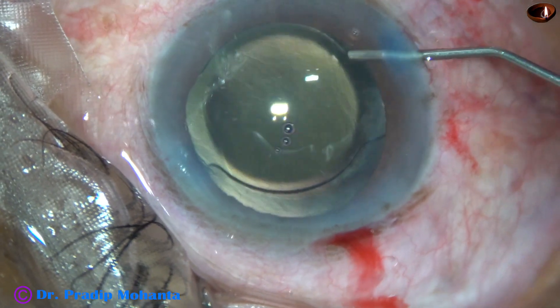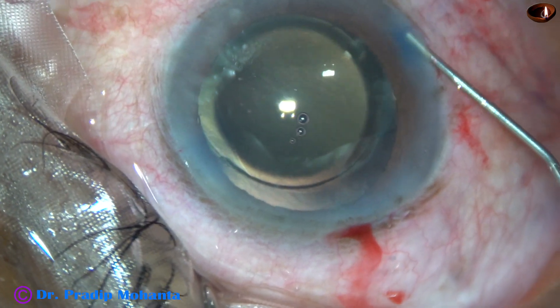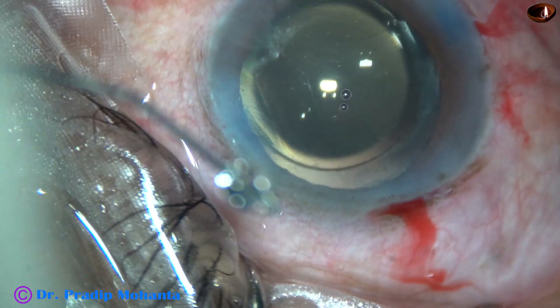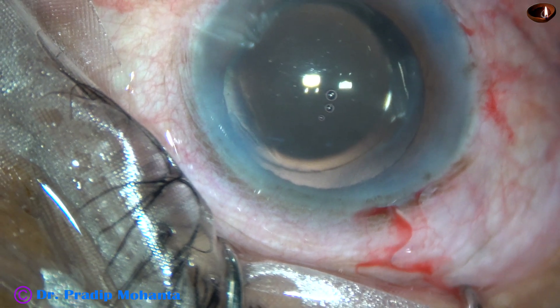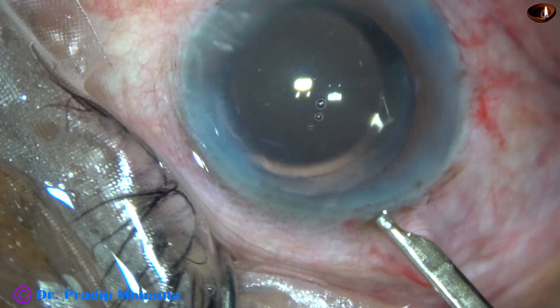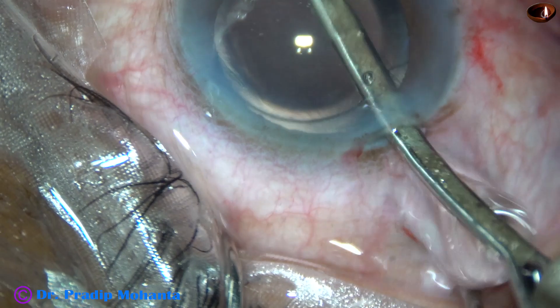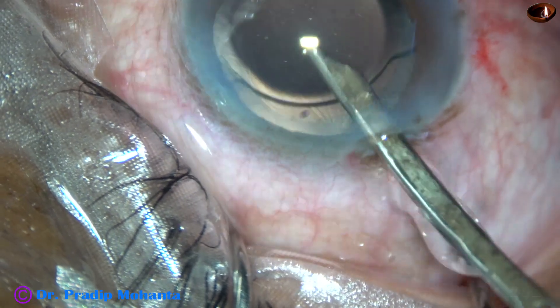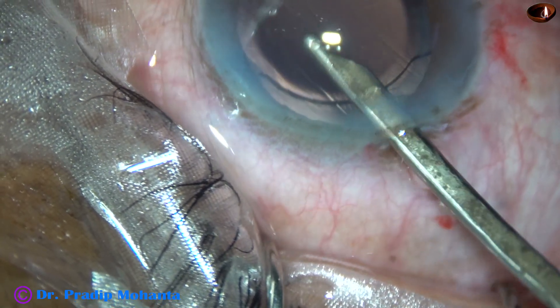Now this is a bit of moxifloxacin instilled. The two side ports are closed by hydrating the corneal stroma on either side of these stab wounds. Before we conclude the case, this is a final lavage of the anterior chamber so that pure BSS remains at the conclusion of the surgery. There is a little bit of cortex at 6 o'clock which was removed at this time.